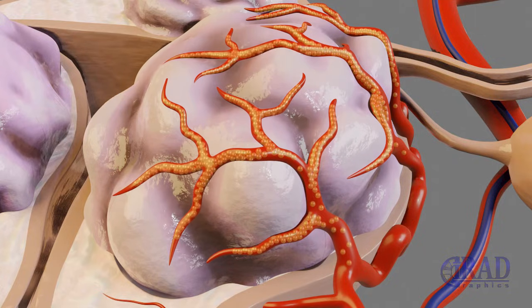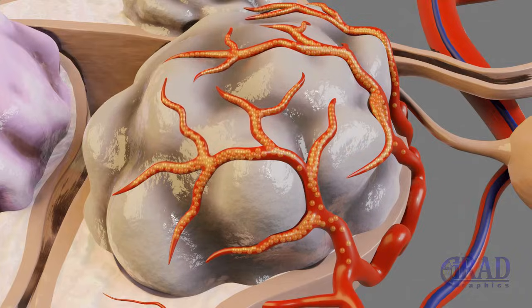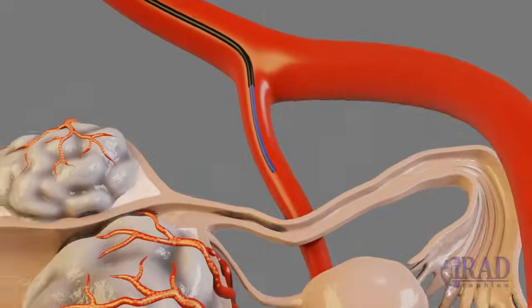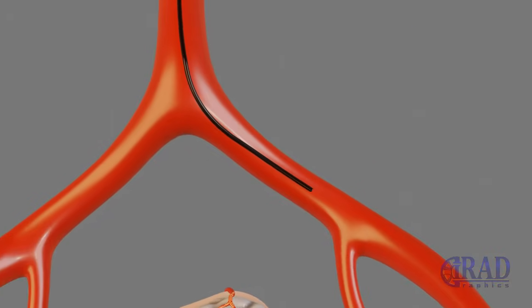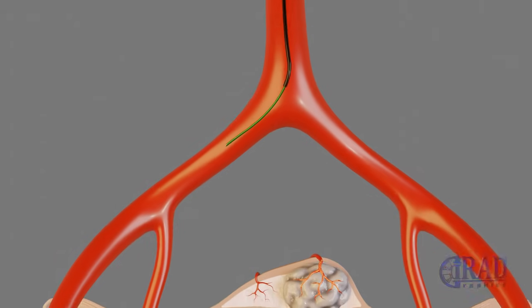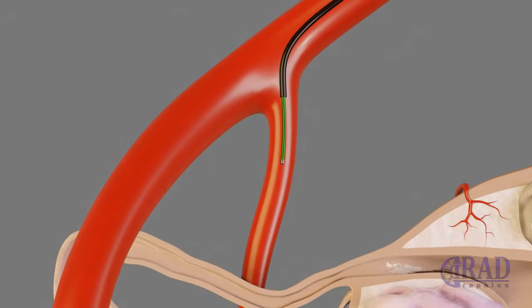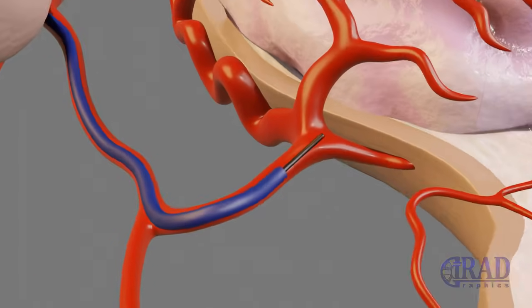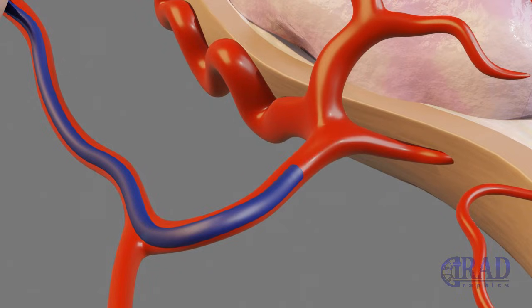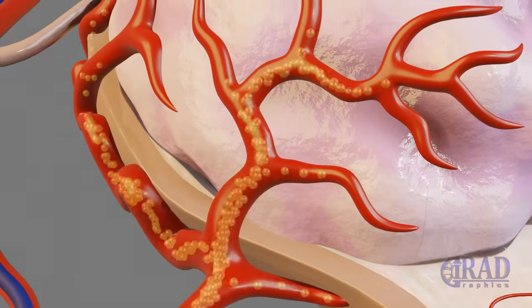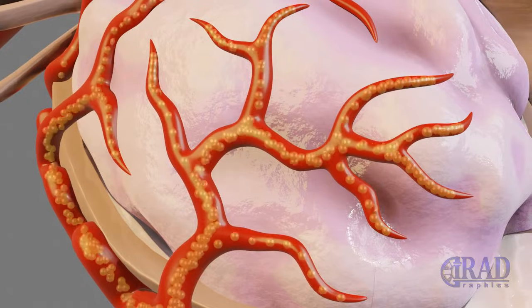The microcatheter is pulled back into the base catheter, which is also pulled back into the aorta and then advanced into the contralateral internal iliac artery. The unwanted collaterals are bypassed in a similar fashion, and similar particles are injected into the contralateral uterine artery until slow blood flow is noted.